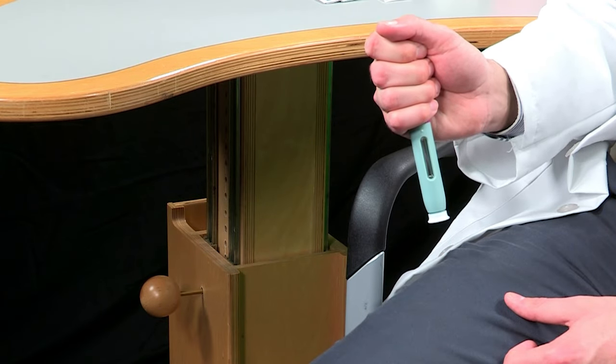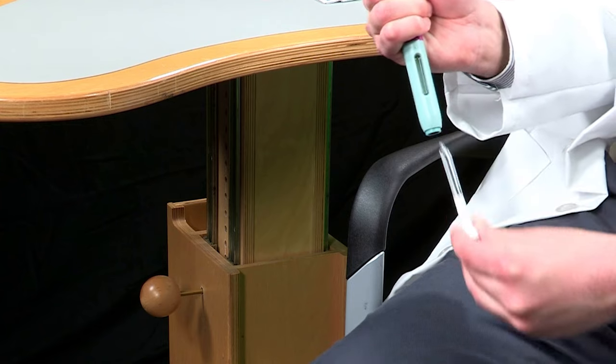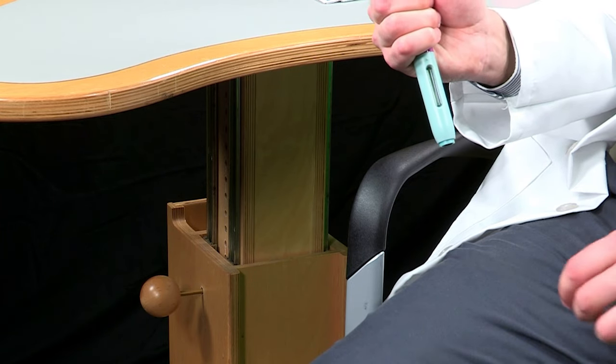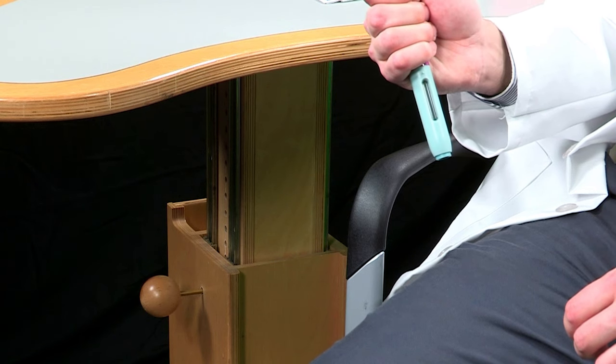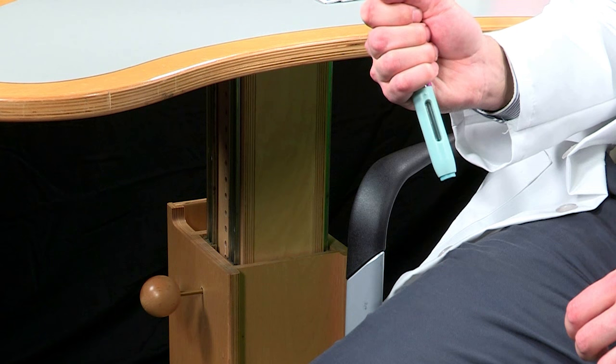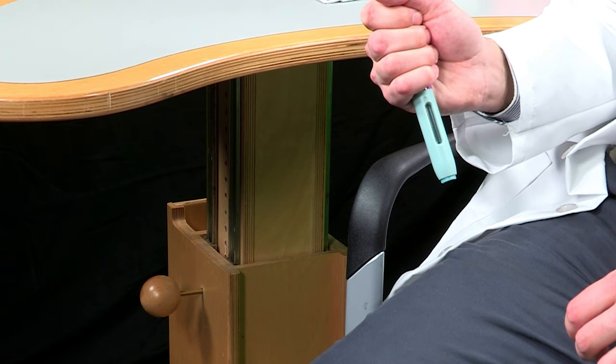When you are ready to inject, pull the white cap straight off. No need to twist or bend the white cap. Don't pull the white cap off more than five minutes before you inject as it could dry out the medication. Don't try to put the white cap back onto the autoinjector even after injecting.